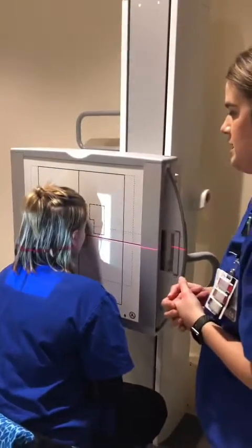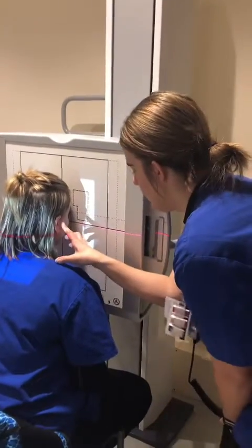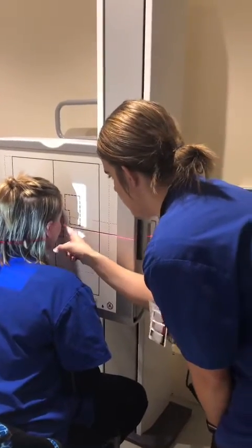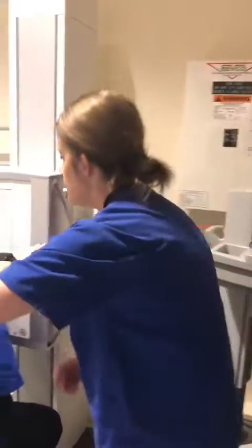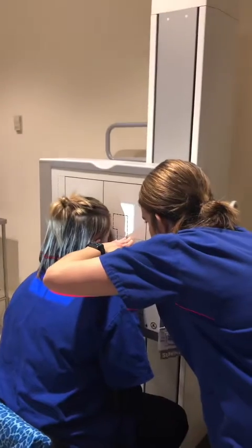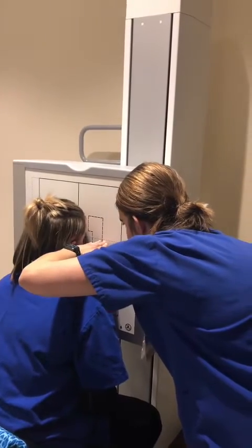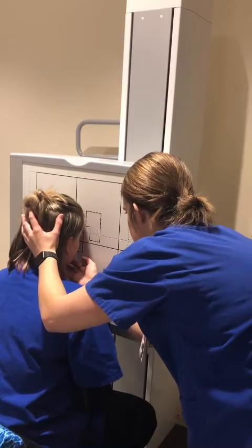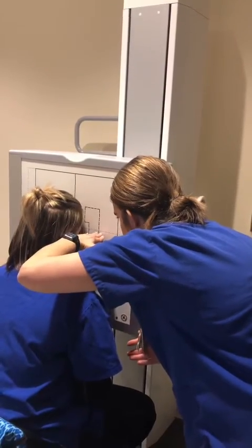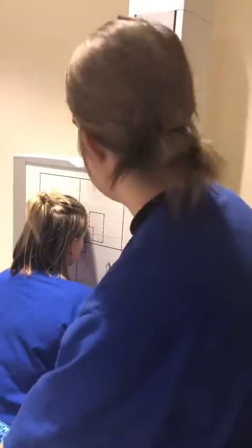So what I'm going to do is come up here and look at where her ear and her eye make a straight line, perpendicular to the image receptor. So I'm going to come up here and make sure that that line is straight. That looks pretty good. I'm going to have you bend your head down just a little bit. There you go. All right. That looks perpendicular right there.